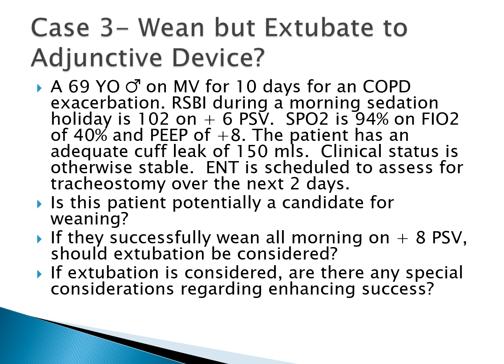If they successfully wean all morning on, let's say, +8 of pressure support, should they be considered for extubation? This one's a little bit tricky, something to consider. Our protocol is we want them down to 5 or 6 of pressure support. We want a decent RSBI on 5 or 6 of pressure support.